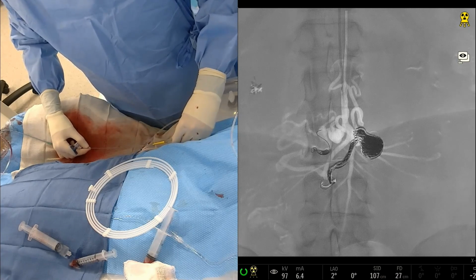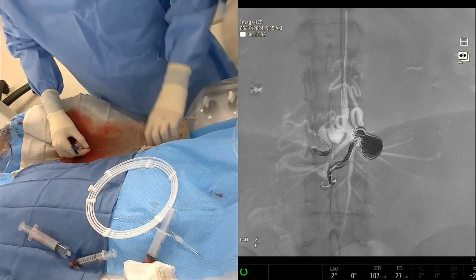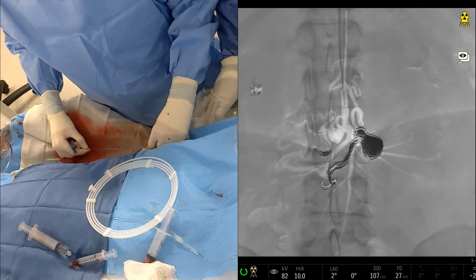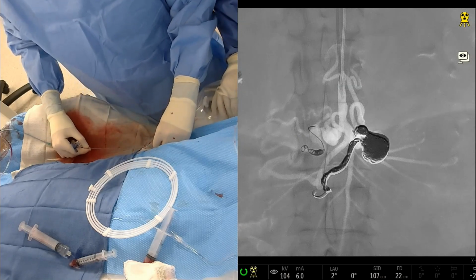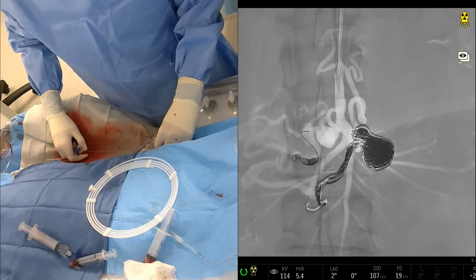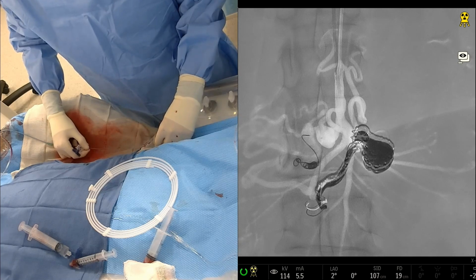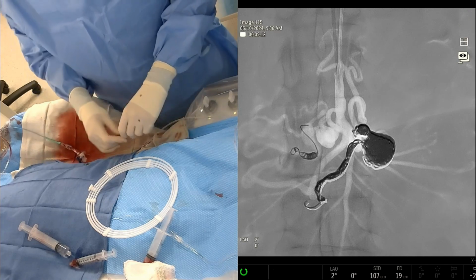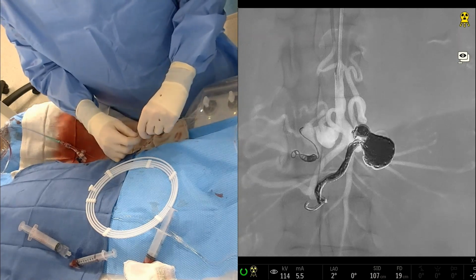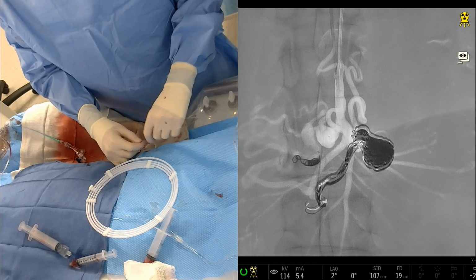That looks like the right size here, I think. Perfect. I don't personally mind having it loop in the aneurysm. I think it allows for better coverage as you pull your catheter back and put some more coils in. Yeah, I agree. I don't think it makes that much of a difference. You're not placing a large device here, you're just putting coil. I think it naturally reduced anyway, it was just hard to push. It's still looped on itself. Perfect.